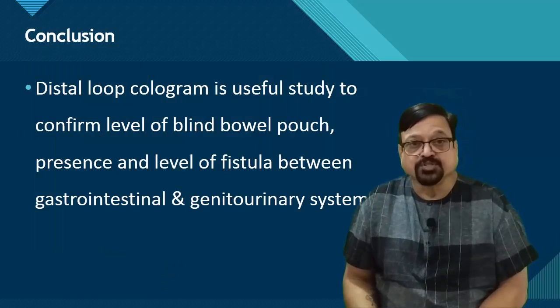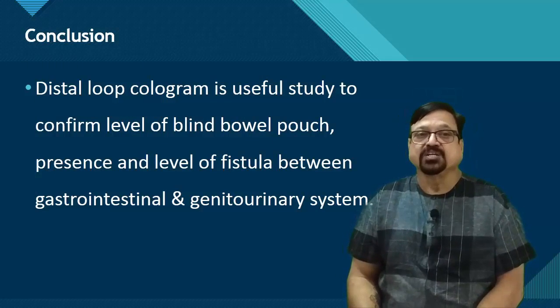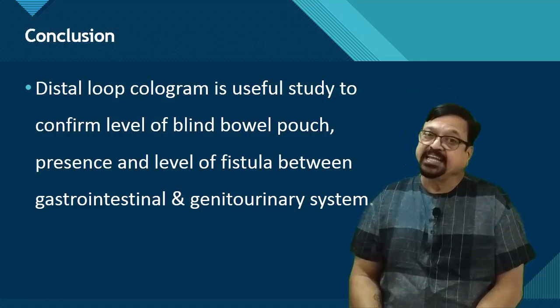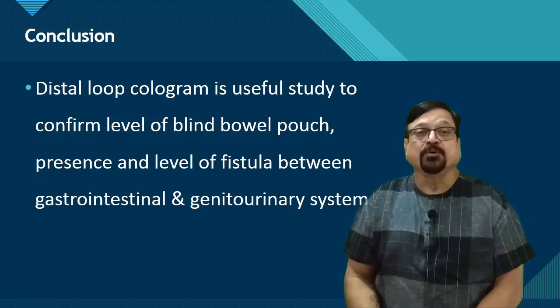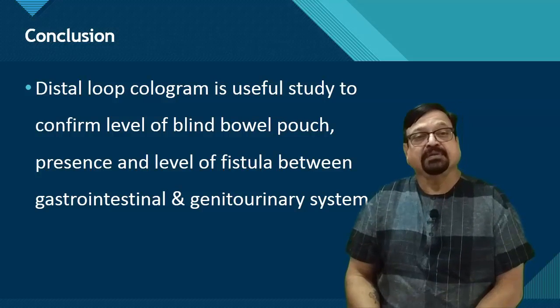We have seen a lot of films. In the last film I have not given the diagnosis. You are supposed to read it. You are supposed to correlate it with the reference diagram, and you are supposed to write your own report with the help of all these things. I have shown you multiple films.